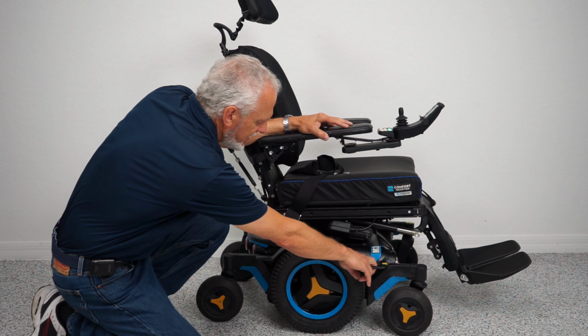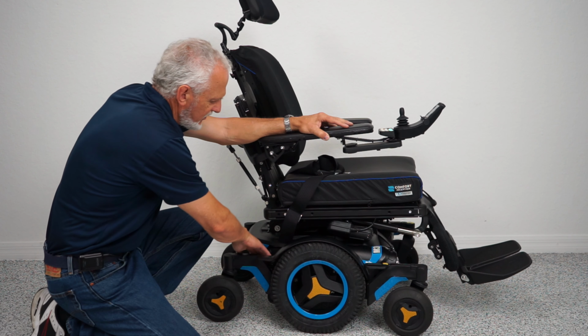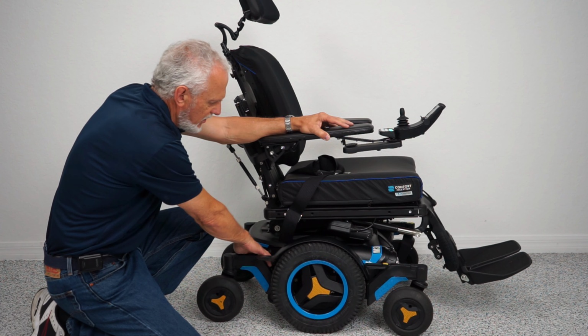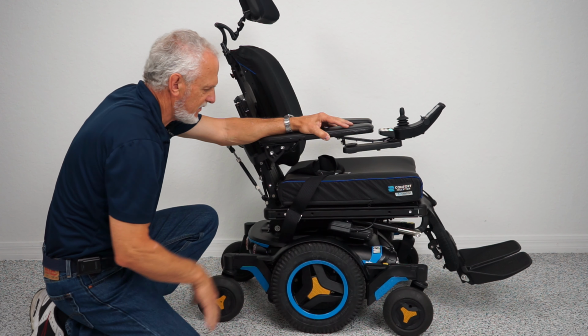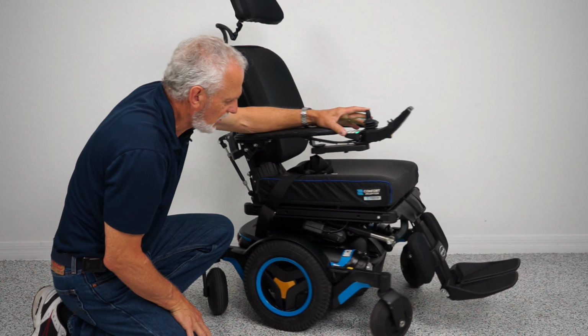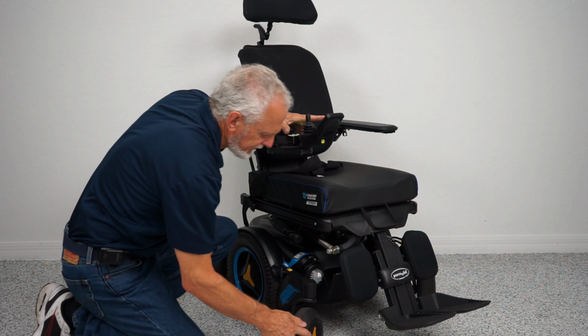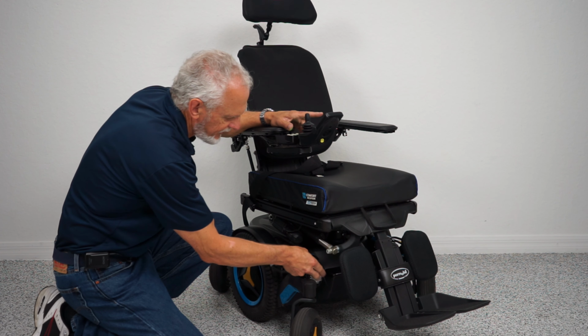You have an anchor point here. This is where you secure your chair to your lift for transportation. Here, there's another one inside by the fork here. There's 2 on this side, 2 on the opposite side, okay? Also, you have a motor right here. You can see the reflector in front here. So this reflector right here is in front of the motor.